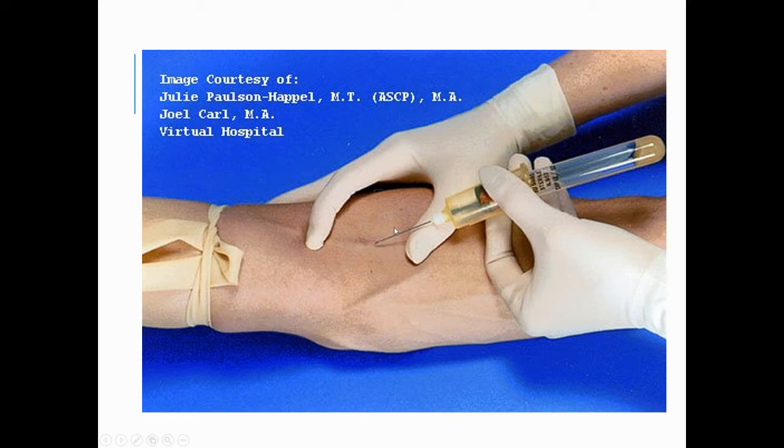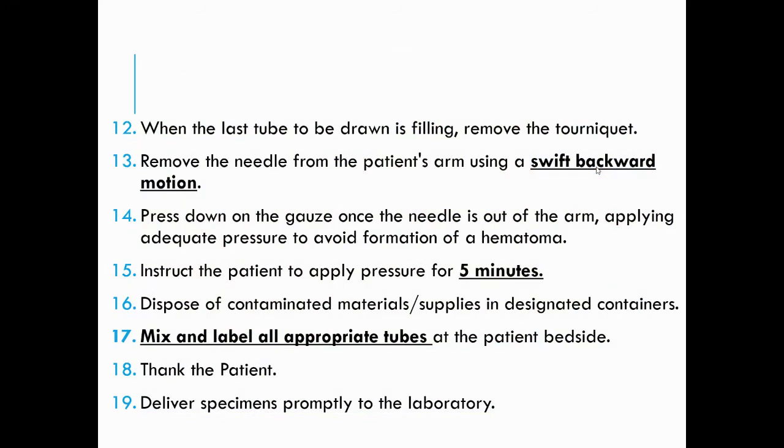We also need to take note that when introducing pressure while pushing the tube into the rubber sleeve needle, you need to hold your adapter firmly, because when you push the tube, the needle may be pushed as well. We need to avoid that. So only the tube should be pushed.